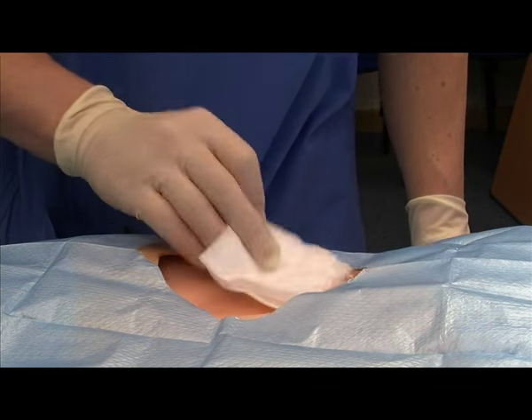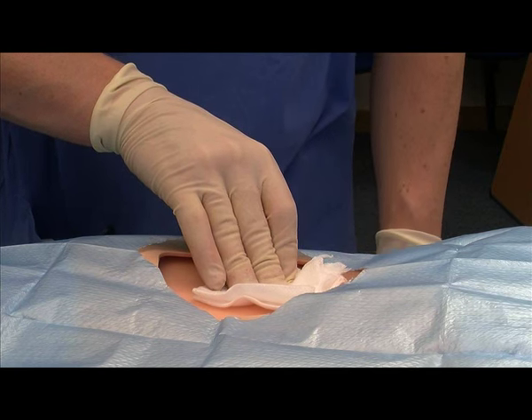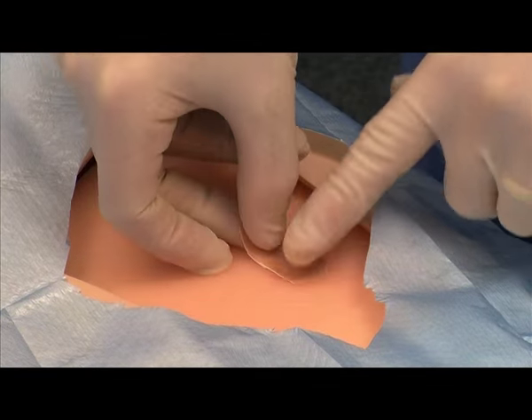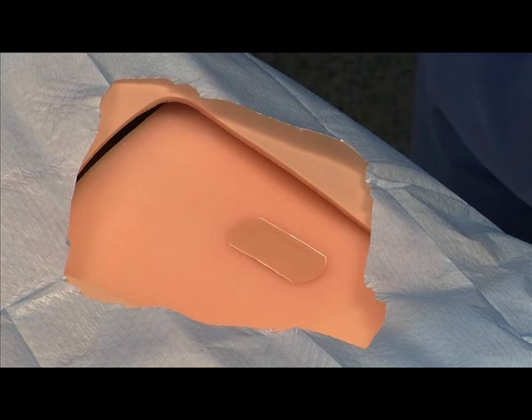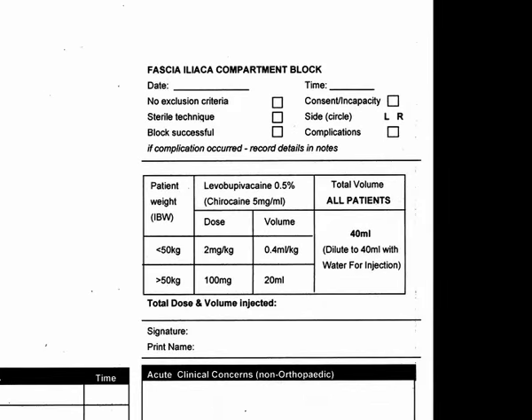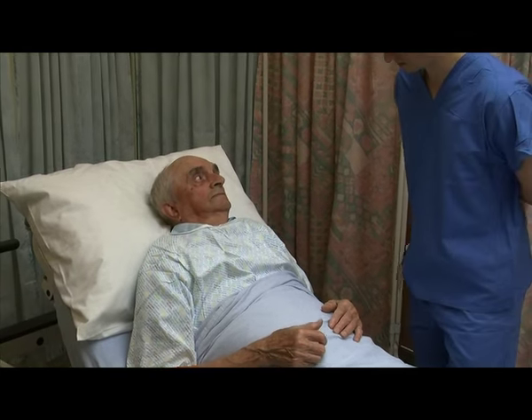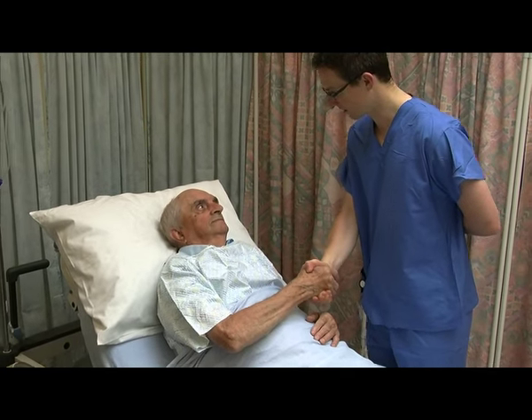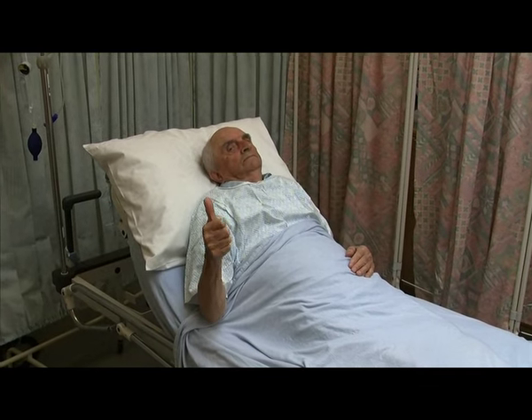Remove the needle and apply pressure for approximately 30 seconds, then apply a simple dressing if required. Thank the patient and document the procedure details on the hip fracture pro forma. Finally, approximately 30 minutes later, review both the patient and their pain score, documenting this result on the hip fracture pro forma.